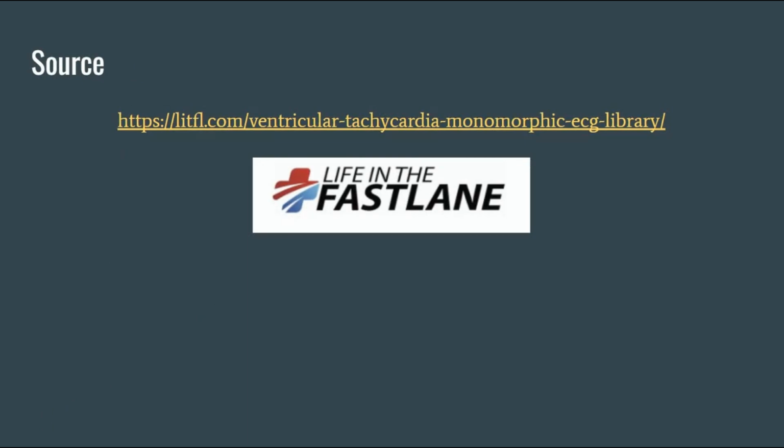Understanding monomorphic VT on ECG is essential for diagnosing and managing this potentially life-threatening arrhythmia. By identifying these key features, clinicians can take timely action to stabilize patients and prevent serious complications.